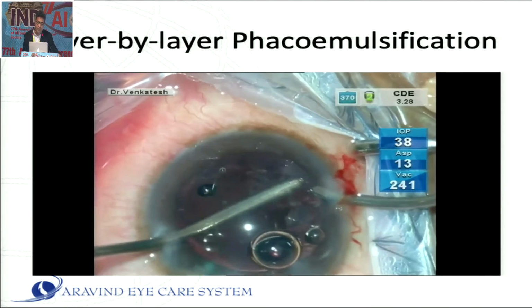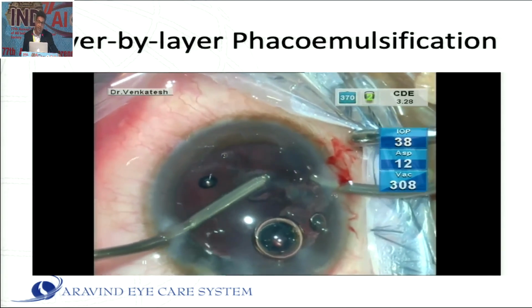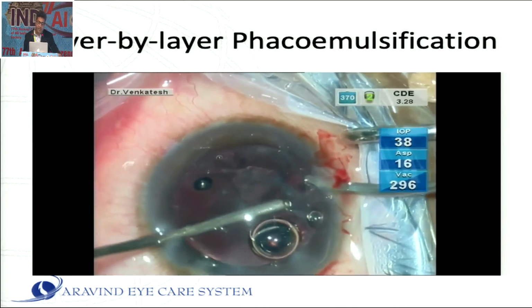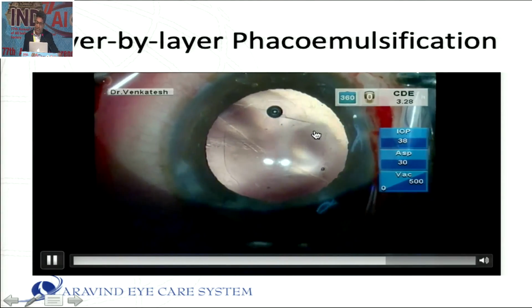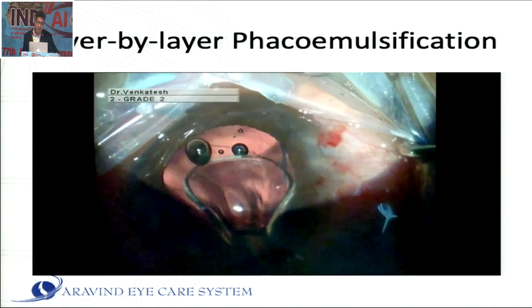Whenever you're switching hands or doing any step, don't allow the chamber to suddenly decompress. And it's so important, you have to be very, very gentle and then do layer by layer and also clockwise by clockwise carefully, because that is where the dehiscence is. You don't want to enlarge the dehiscence. In spite of all this, there is a slight enlargement if you see on the lateral side, but fortunately no material was lost. Whenever you remove the last plaque, you have to be very careful.